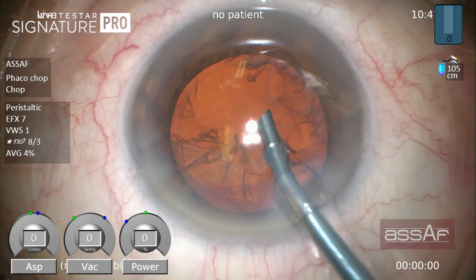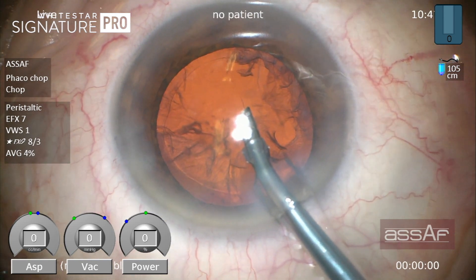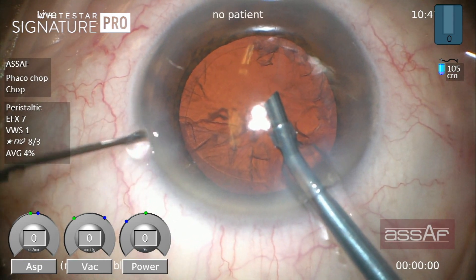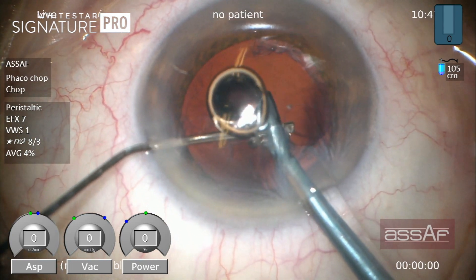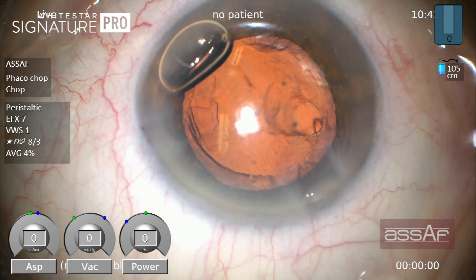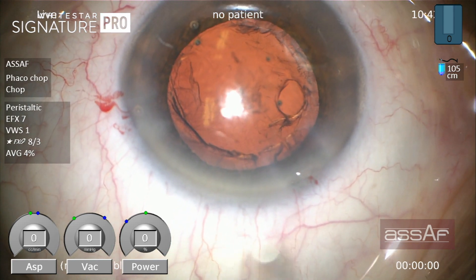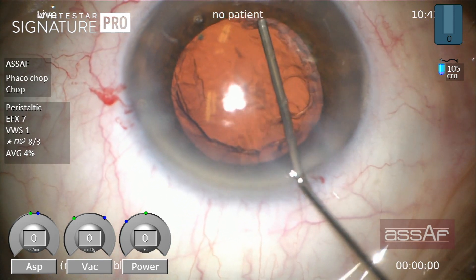Now I have realized that there is a break inside the posterior capsule. I didn't withdraw the phaco tip outside the anterior chamber until I inflated the anterior chamber and injected dispersive OVD inside the anterior chamber to tamponade the vitreous and prevent further vitreous prolapse. Then I moved forward for cortical cleanup by manual aspiration of the cortex.